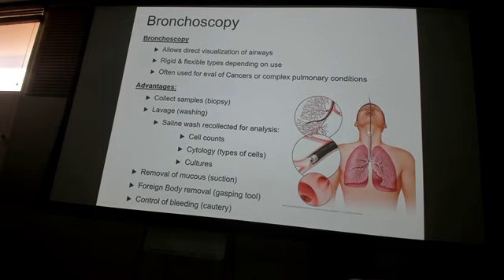Bronchoscopy, right? There's really not a common reason why you do this in pulmonary, or in primary care. You may use this in the ER, but it's a good diagnostic and treatment tool. Very rarely do you ever see the rigid bronchoscopies. They're typically flexible, so that you can go down further into the bronchioles. But it has a lot of ports on there, so you can collect samples, you can do a biopsy. It has a little cautery in there, it has little graspers.